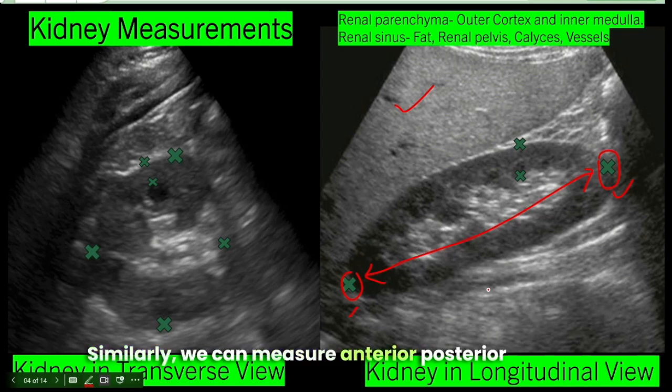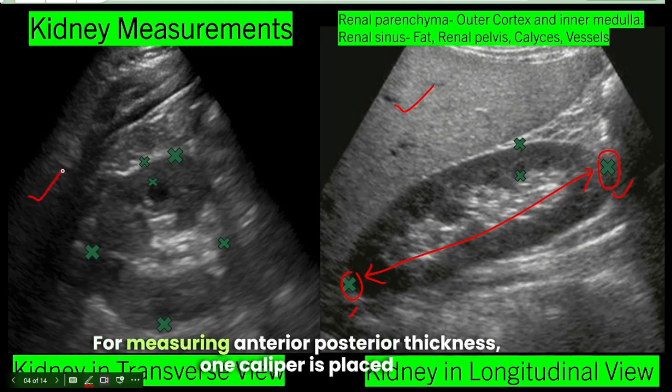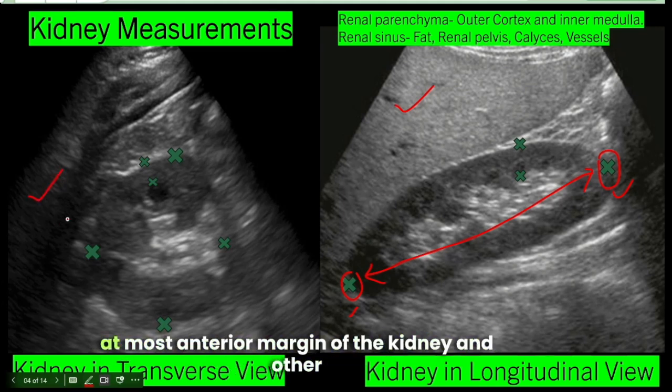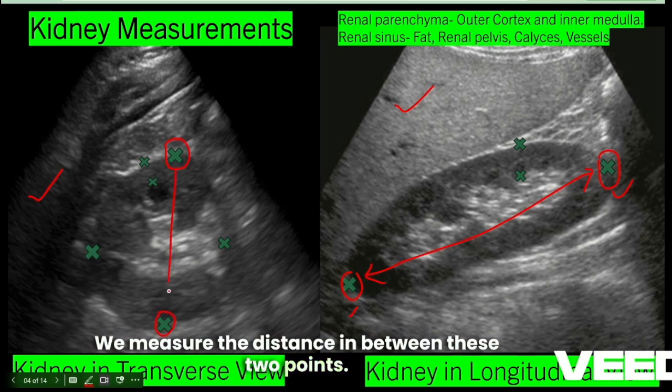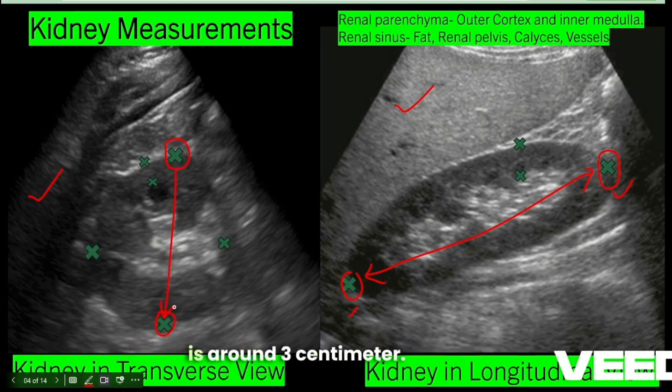Similarly, we can measure anteroposterior thickness and width in transverse image. For measuring anteroposterior thickness, one caliper is placed at most anterior margin of the kidney and other is placed at most posterior margin of the kidney. We measure the distance in between these 2 points. Normal AP thickness of the kidney is around 3 cm.